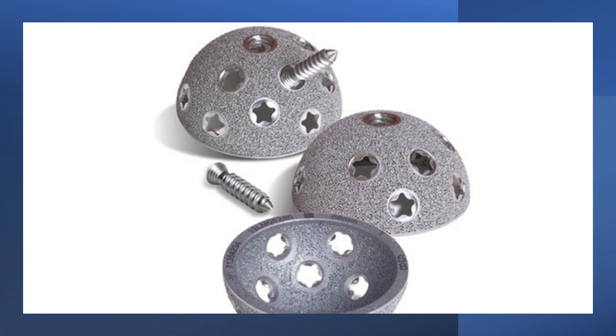We have a cup, which is a hemisphere. On the inside we place a polyethylene liner. On the convex or outer side, we have a roughened macro texture into which bone will grow over time, and holes that create the option of placing a screw into the pelvis to augment the fixation of this cup in the acetabulum.